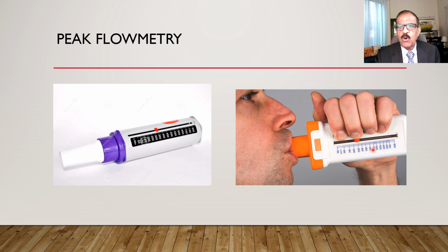So you will record the reading. The strength of this equipment is it is extremely simple, no gadgetry, no battery, no electronics. So I think patient can do it as frequently as the patient wants.